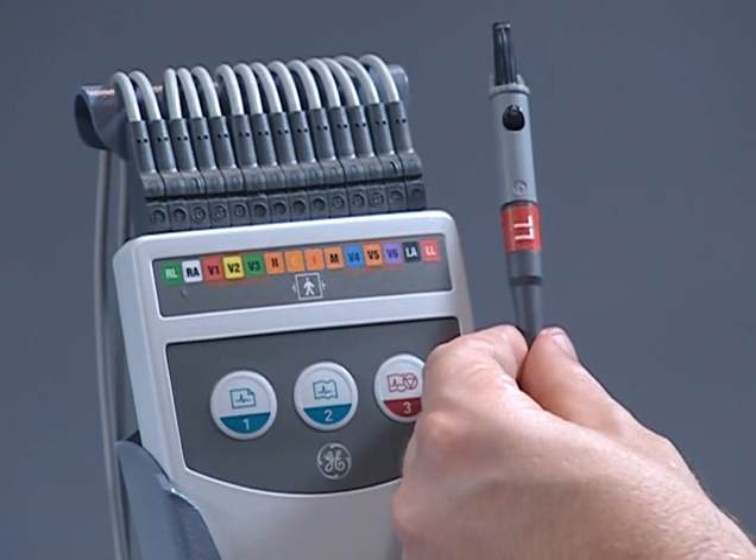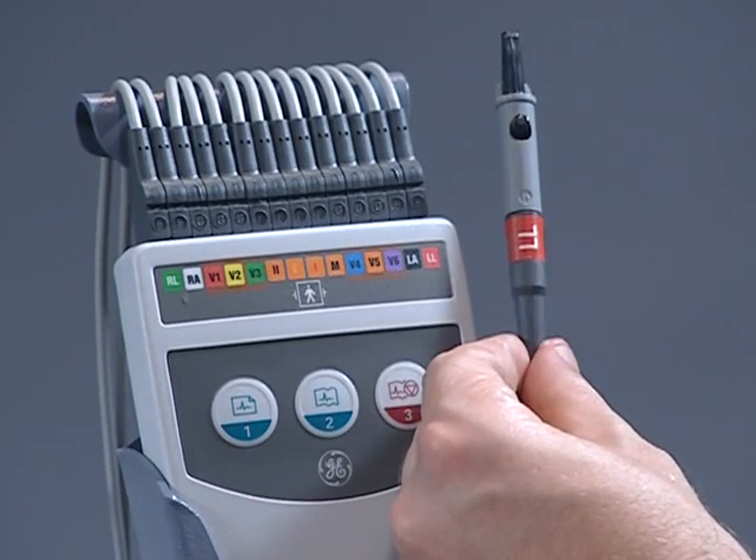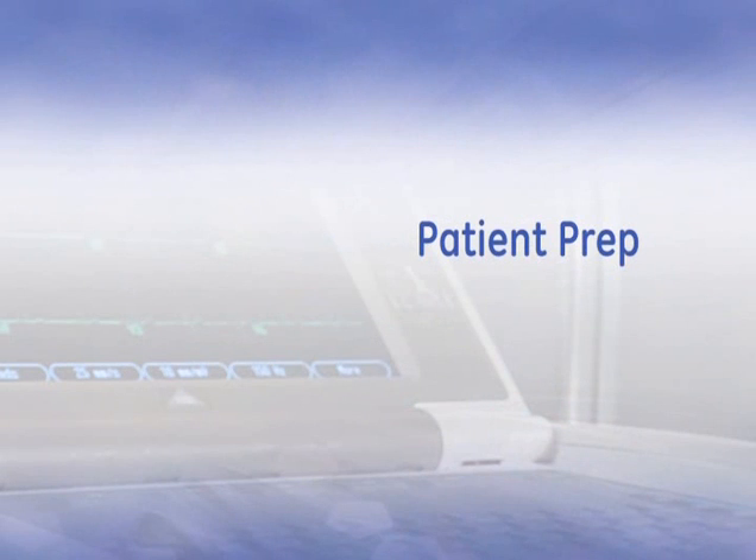The clip at the end of each lead wire is attached to the appropriate electrode during the ECG. In order to reduce noise and artifact in your ECG tracings, perform good patient skin prep. For maximum quality, this is what we recommend.